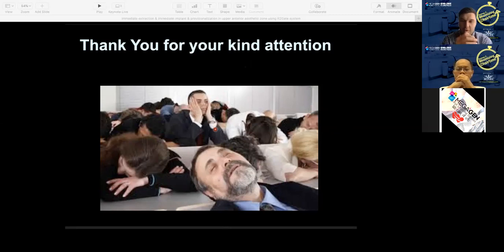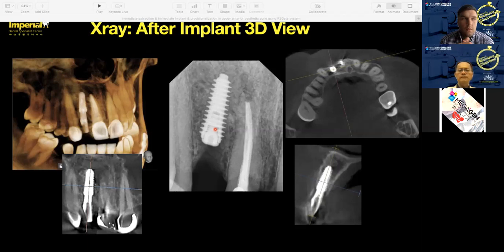So okay. As you were talking about the immediate implantation and immediate loading, all the time you were talking about the initial torque value. So my question would be, how do you evaluate how it is possible to reach your desirable initial torque value?